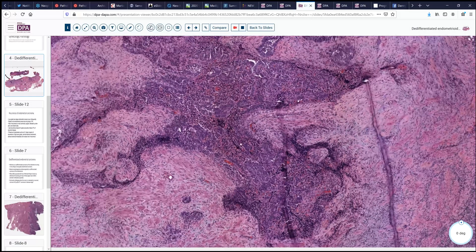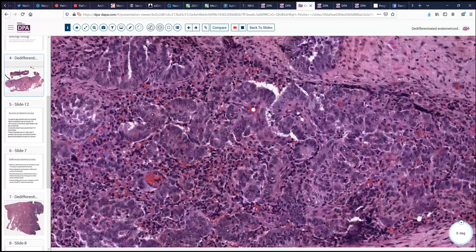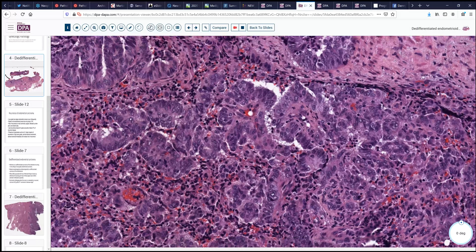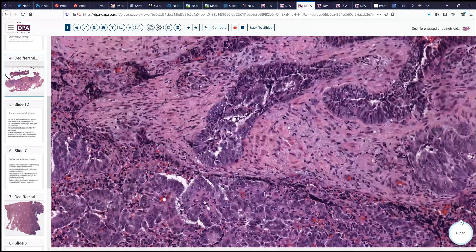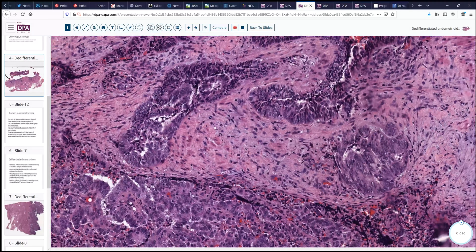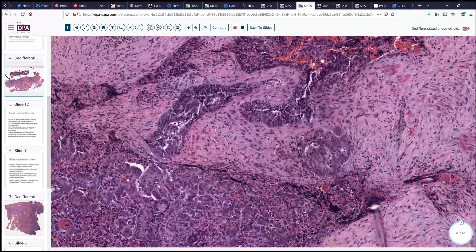As we look at this at a little bit higher magnification, we do see here some glandular structures. These areas obviously have an epithelial component. It's a fairly high nuclear grade type of tumor, but clearly it's got some epithelial character to it with a bit of glandular evidence. That's greatly helpful, and could represent recurrence of her initial endometrial tumor, because here we've got a nice gland-forming tumor infiltrating into the soft tissues.